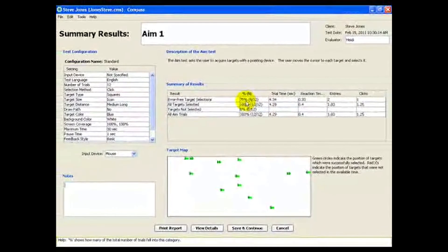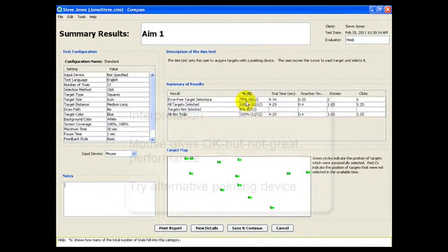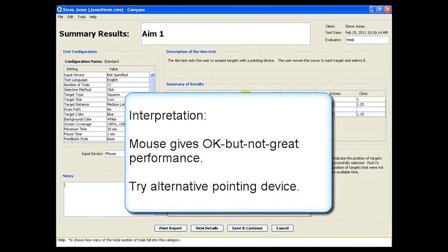So overall, this baseline data for Steve suggests that he is reasonably functional using his mouse, but that there is still some room to improve both speed and accuracy.